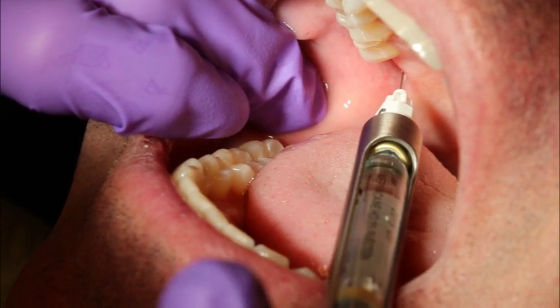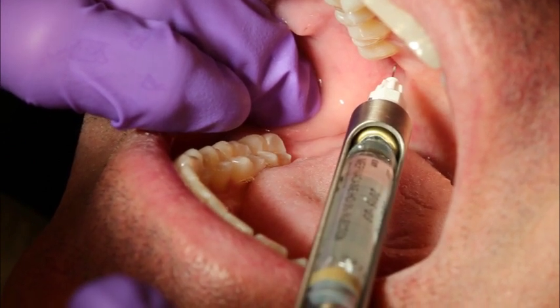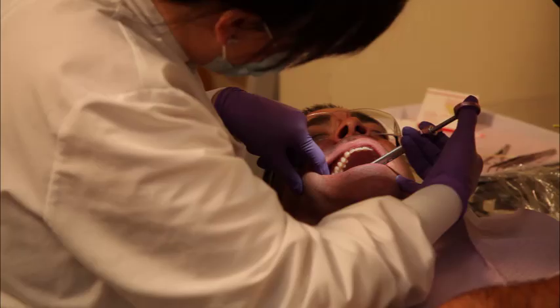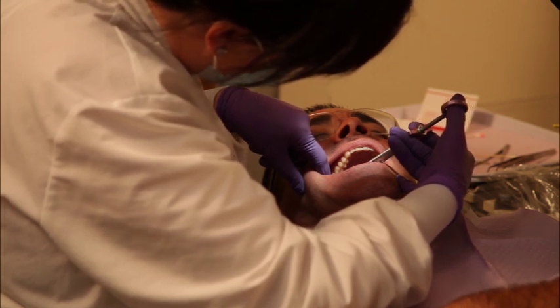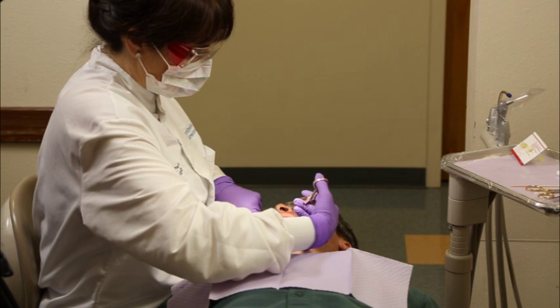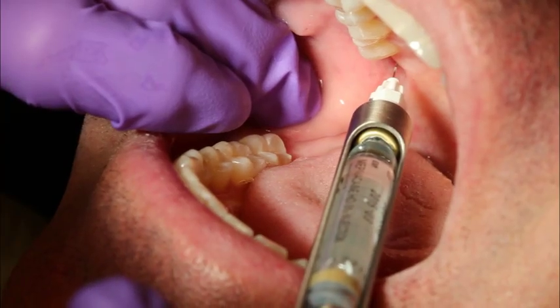First, aspirate as usual at the depth of penetration. If aspiration is negative, rotate the syringe barrel gently towards yourself and reaspirate. If the second aspiration is negative, rotate the syringe barrel gently back to its original position and aspirate again. If aspiration is negative, slowly deposit 1.8 milliliters, or 1 cartridge, over 60 to 120 seconds.